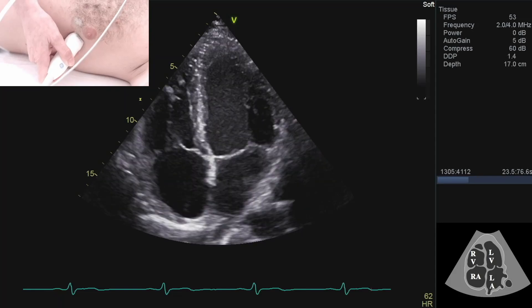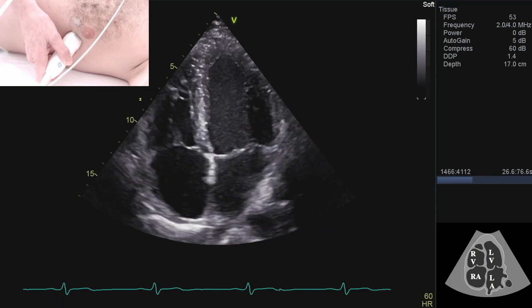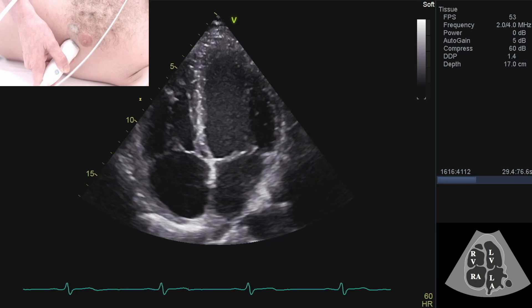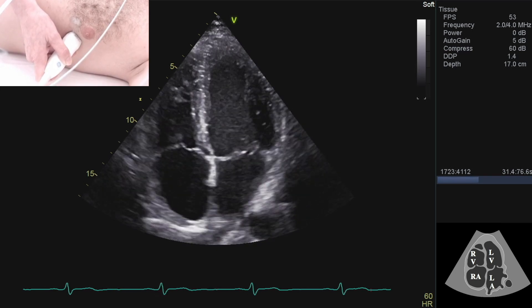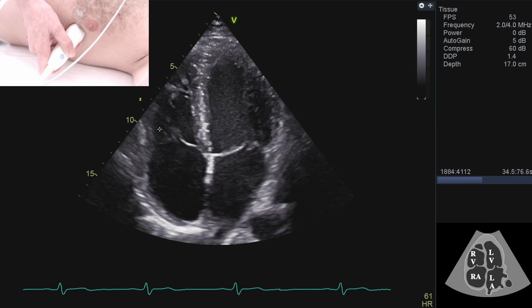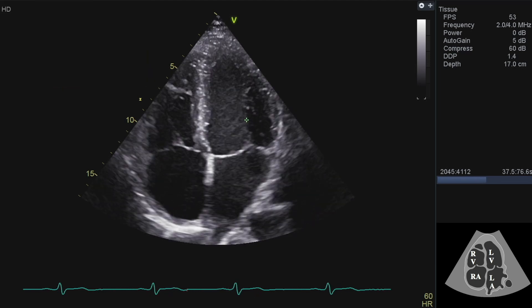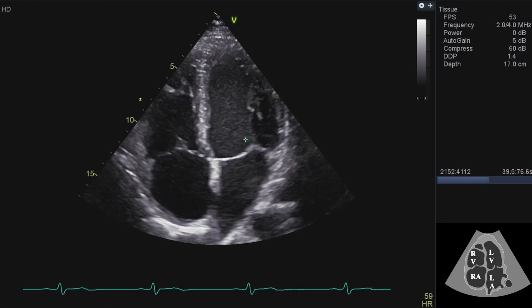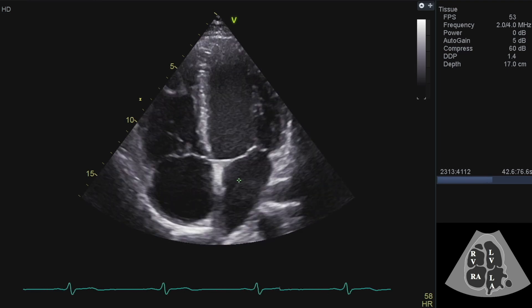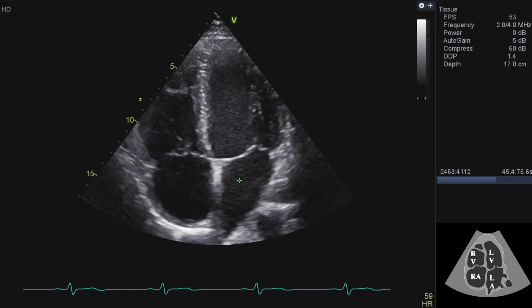This is my apical four chamber view. It's a really nice view for seeing all the chambers laid out side by side, so you can see their relative sizes. We can see that the right ventricle is about two thirds of the size of the left ventricle, the atria are very similar sizes, and they're considerably smaller than the two ventricles.